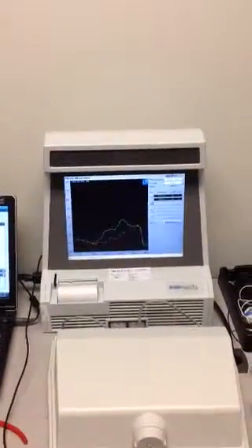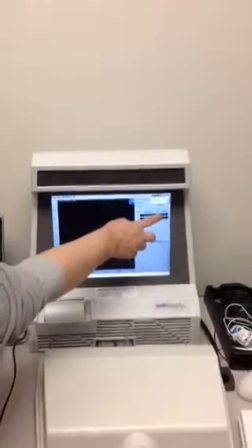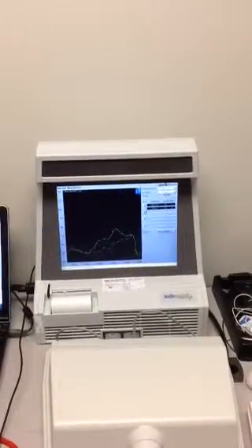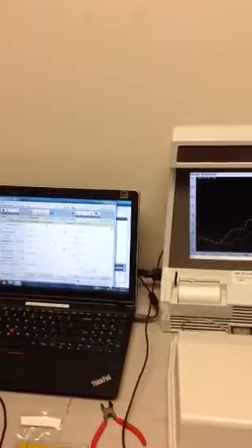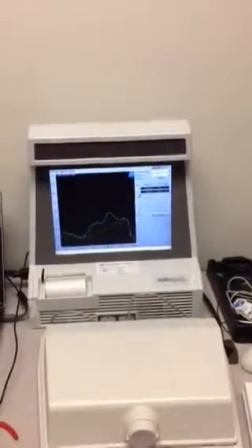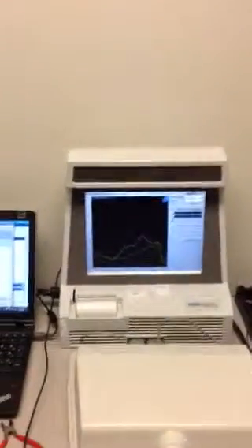So that actually looks pretty good. So when you're looking at it here, it'll say F and B for speaker placement corresponding to the tracings on the screen. So that's not looking too bad. It does confirm that the hearing aid is working. So our directional microphone is wired correctly and it reacted appropriately to the spatial and spectral separated signals.